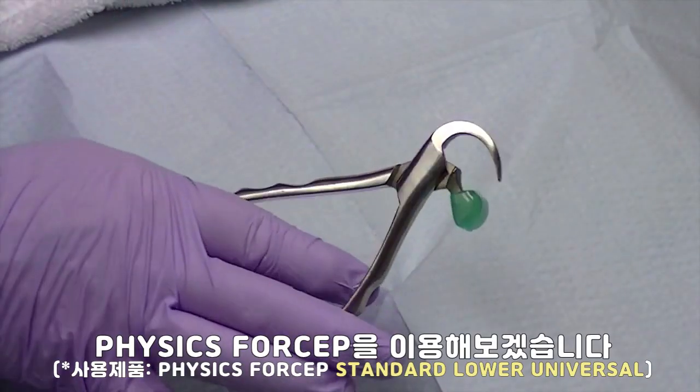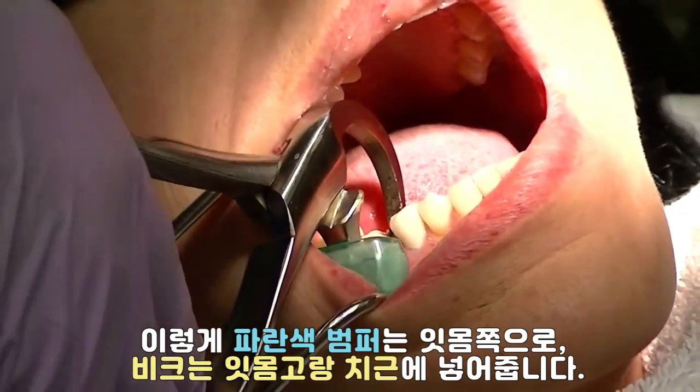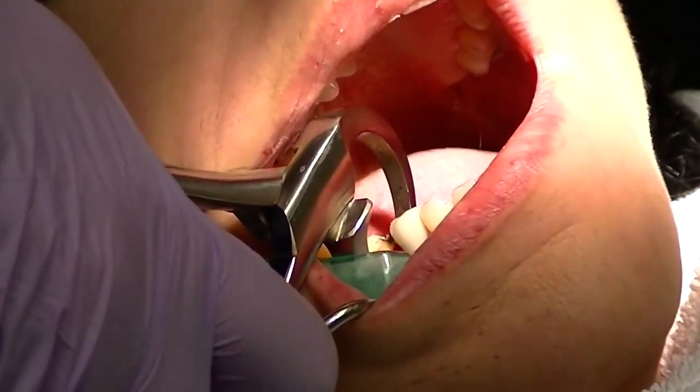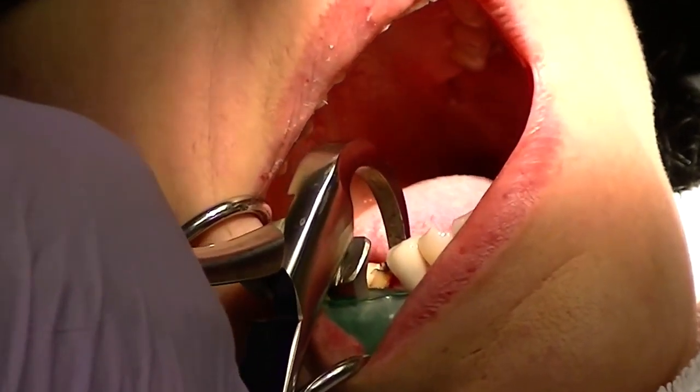The working end of the instrument is simply the beak. Your nose is holding the handles firmly, and you rotate the wrist to create tension onto the lingual aspect of the root structure. This will create a physiologic effect, breaking down the periodontal ligament.